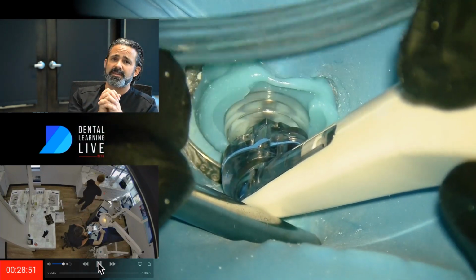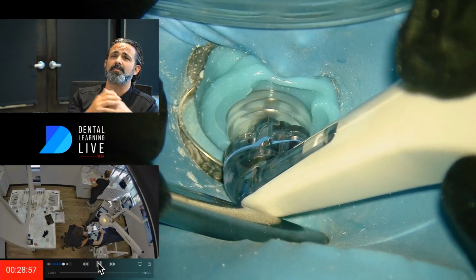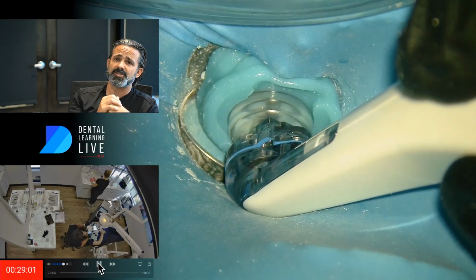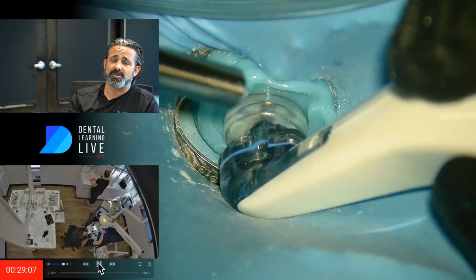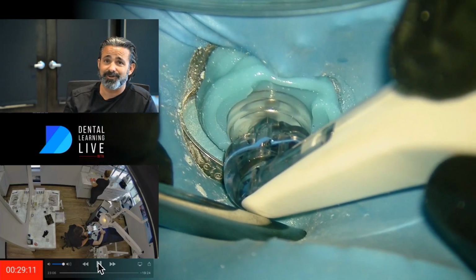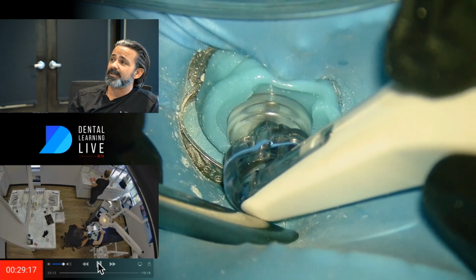And that's something I think as a doctor we've got to be really aware of, and make that decision ourselves based on what we're observing, and stay really committed to the procedure. Also stay really committed to the patient. If you're pushing too hard, sometimes there's a tendency, especially in a case like this where you're trying to line things up just right, that you're pushing the patient's chin down. So don't do that. You'll find you don't have to push very hard. We're heavy-handed as dentists at times, so don't do that. You realize, I don't need to do that.